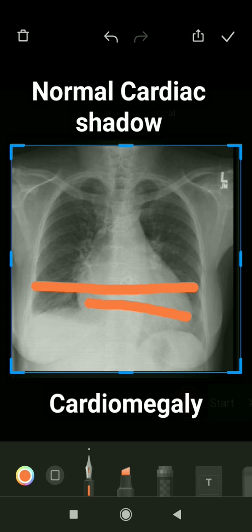Normally, the transcardiac diameter should be half of the transthoracic diameter — that is normal. In this case, we can clearly see the transcardiac diameter is more than half of the transthoracic diameter. Therefore, we can conclude that this patient has cardiomegaly. Thank you very much.